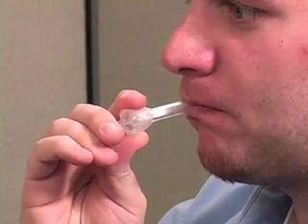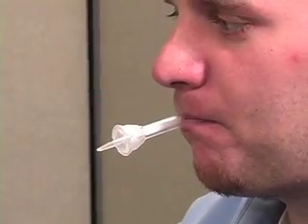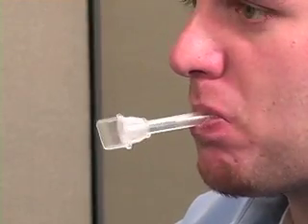The donor sweeps the inside of the mouth several times and then holds the swab in the mouth. The goal is to saturate the sponge with saliva. The swab must remain in the mouth until color appears on the saturation indicator strip, two to three minutes for most donors.